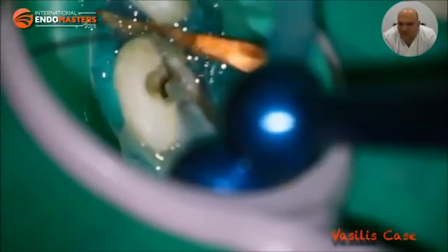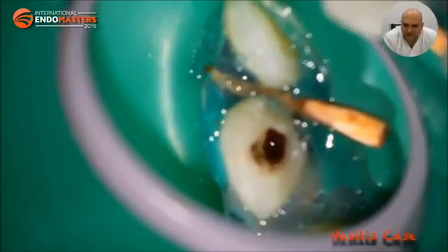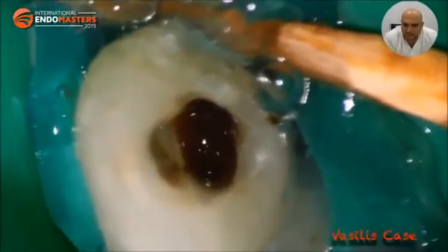The length was transferred to the macrocannula of the EndoVac, and apical negative pressure irrigation of 6% sodium hypochlorite was used for the disinfection of the immature root, followed by irrigation with 17% EDTA to let some dentin-derived growth factors be exposed. After drying the canals, bleeding was induced with a file mounted in a file holder, and you can see the bleeding from the wide canal, and Biodentine was placed and mixed with the blood.